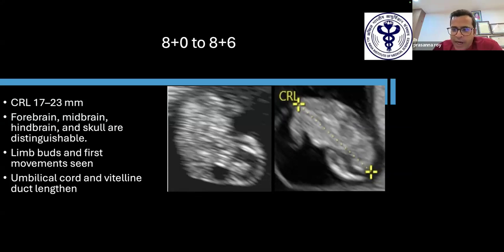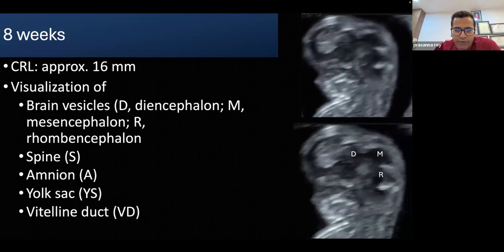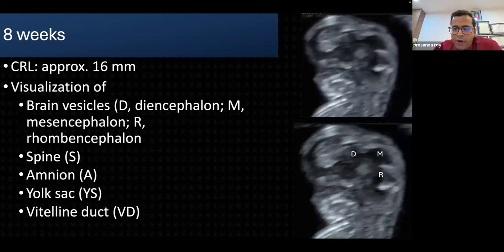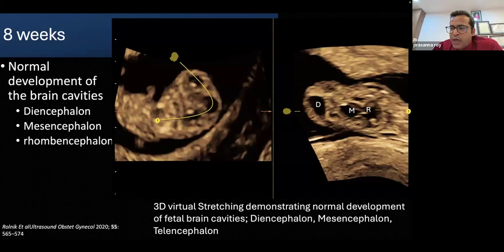We can easily make out the spine and predict acranias and encephaloceles during 8 to 10 weeks of gestation. And we can also do a detailed brain morphology by 3D inversion techniques and TUI, so that we can also predict holoprosencephalies during 10 weeks of ultrasound if the telencephalons are not developed. So knowing the brain morphology will also be important when we are doing this 3D.